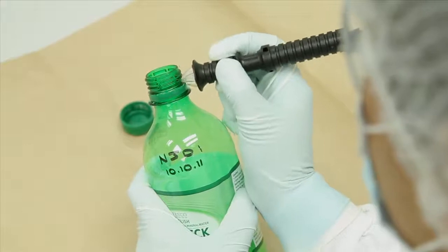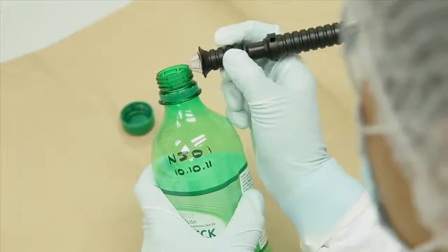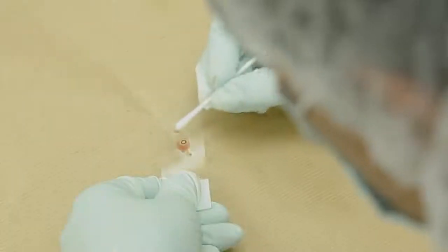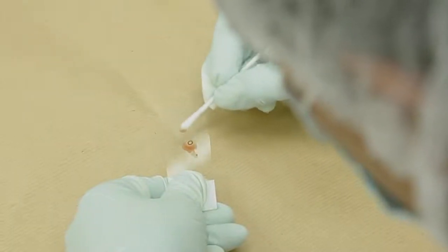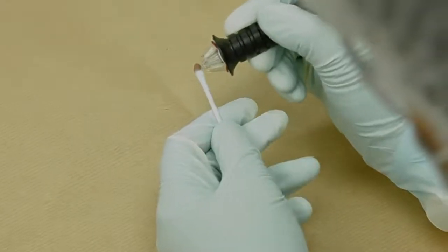There are two methods of sampling. The first is direct sampling, where DNA is recovered directly from the item. Alternatively, indirect sampling uses a swab to recover the DNA, and the swab is then sampled with the collector.